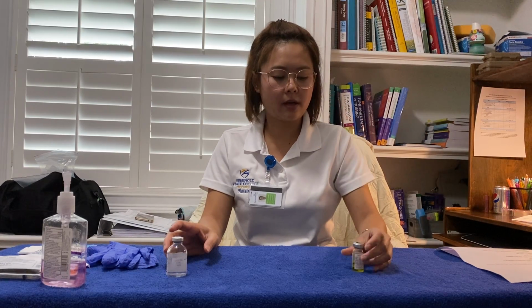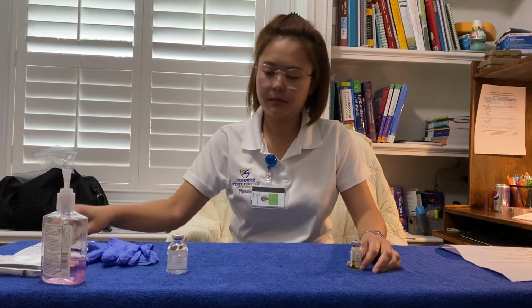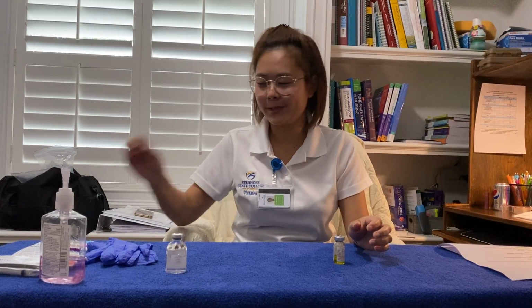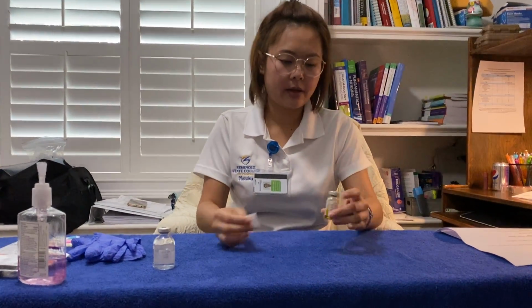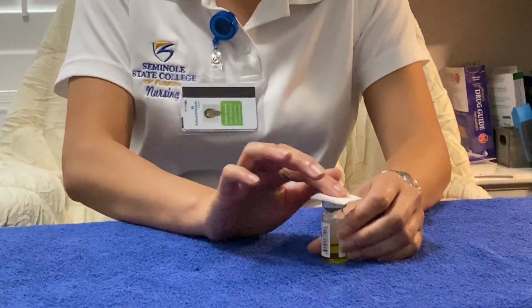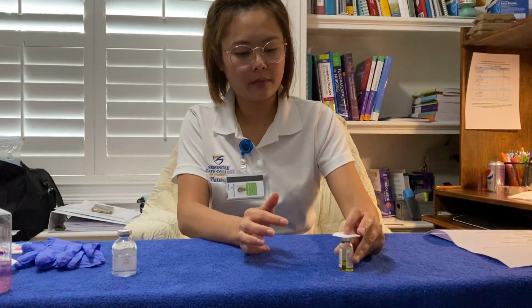Alright, I'm going to start preparing my medication. I'm going to do my flu shot first. Technically I would have a new alcohol pad, but I'm out of them, so I'm going to use this one. I'm going to open my flu shot. This is the single dose. I'm going to clean the rubber stopper for about 20 to 30 seconds, and then I'm going to leave the pad there so I know this has been cleaned.